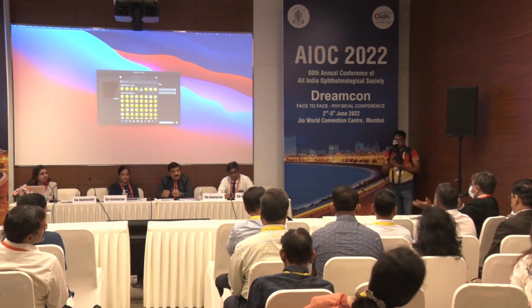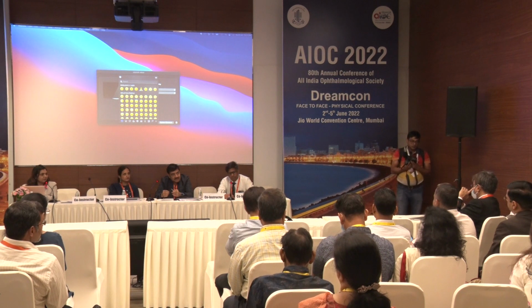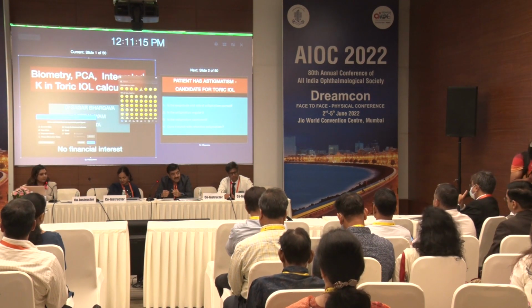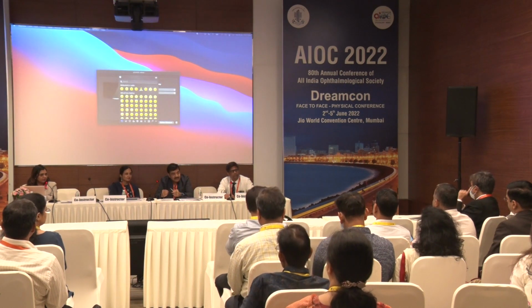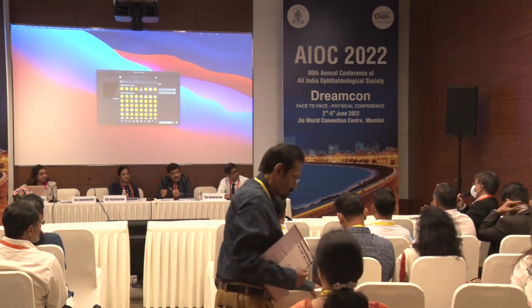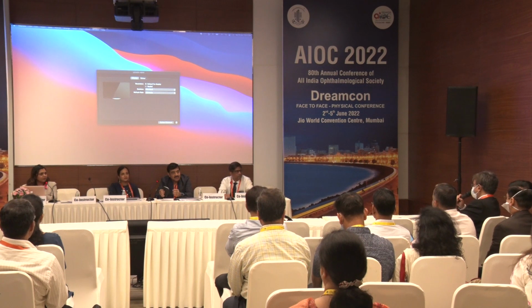But if the other eye was operated earlier and the patient has plano vision, and in one eye I got a 0.5 cylinder, then my target is to reduce that cylinder also. But if the other eye, operated earlier, has 1 cylinder and the patient is okay, then I operate with a normal monofocal lens in the other eye, without implanting a toric.